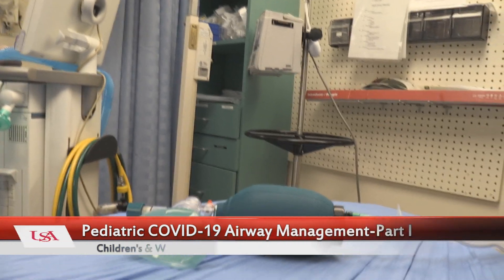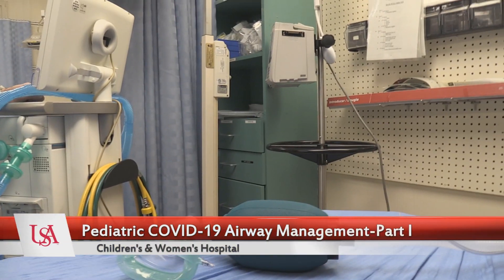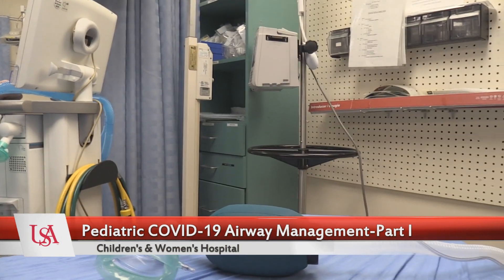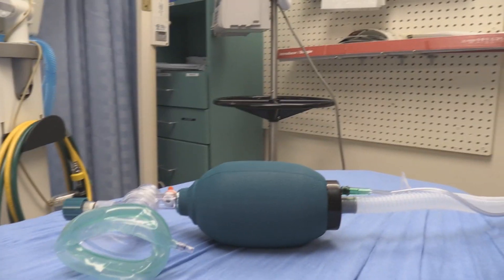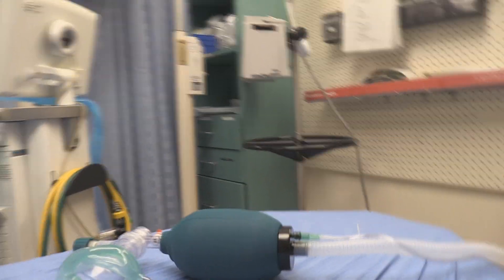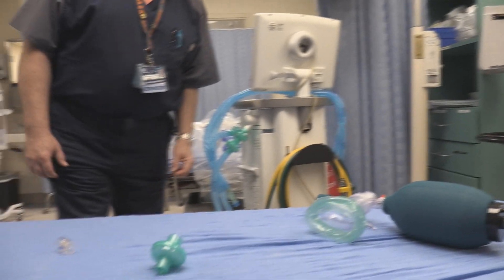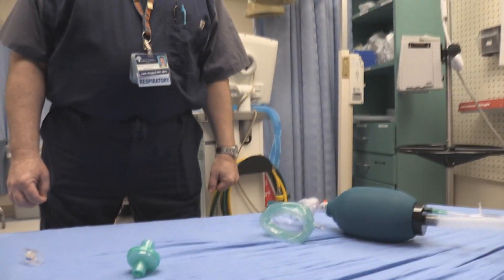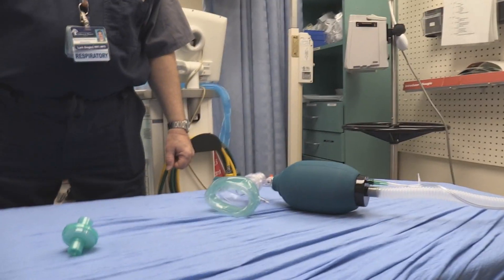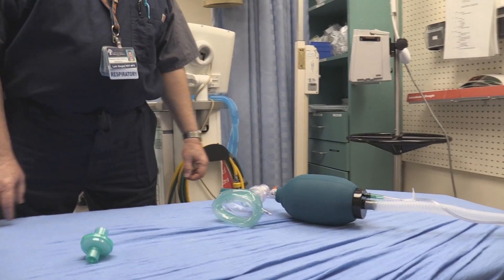What we want to do is review how we're going to manage a potential pediatric SARS-CoV-2 or COVID-19 patient, and this has to do with ventilation and airway management. We're going to review the bag valve mask options here and our respiratory therapist is going to help me. So Lark, show me how you would improve our system to prevent infections on the healthcare providers.